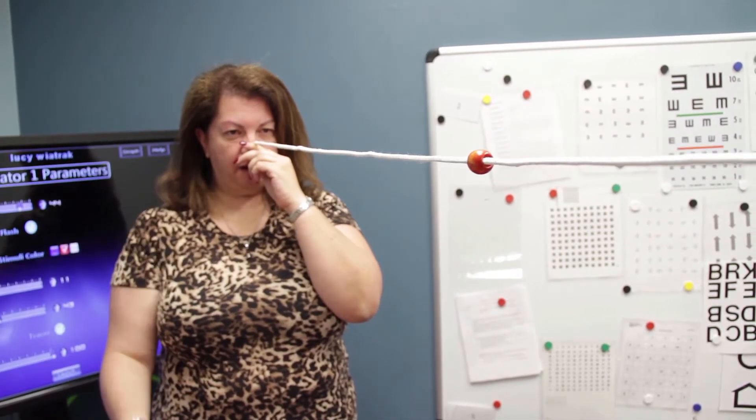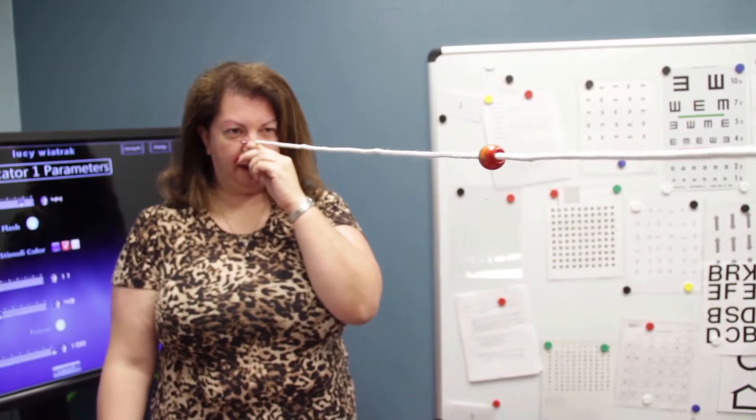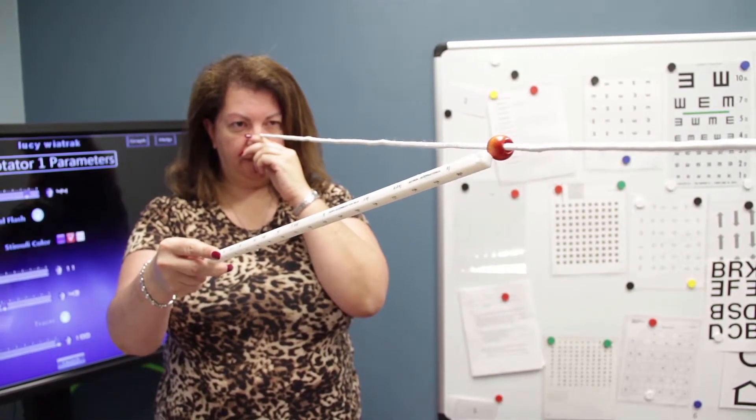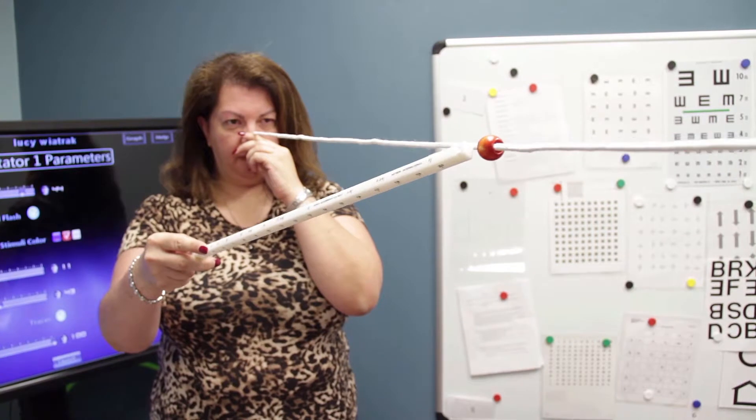Yeah. Good. Don't. I just do it once or something until it... Well, you can hold it there. I want you to maintain it. Can you keep it there? Keep it crossed right at the bead?